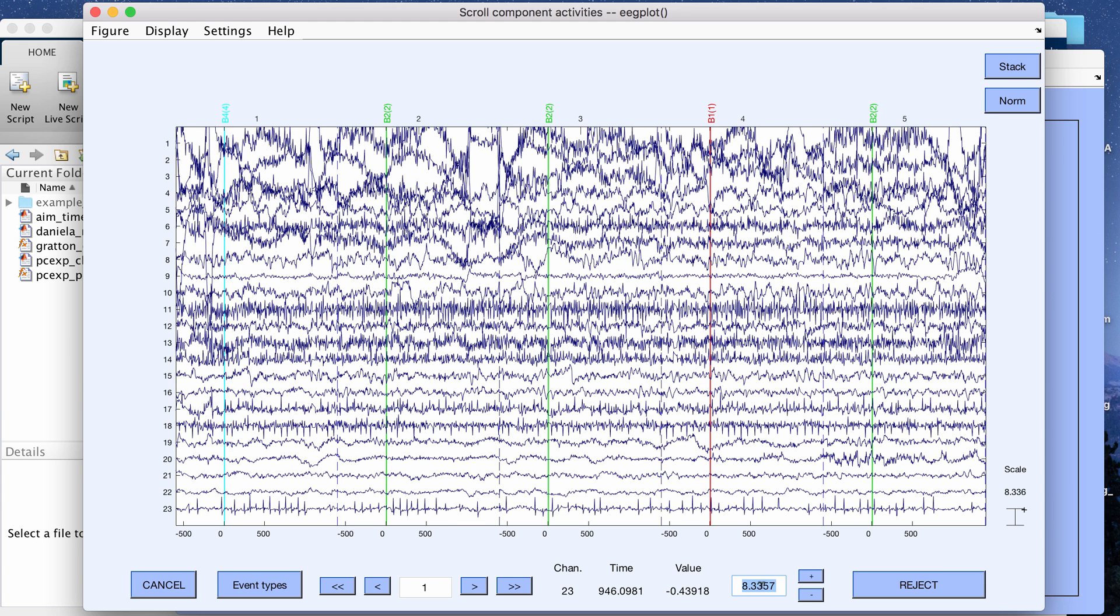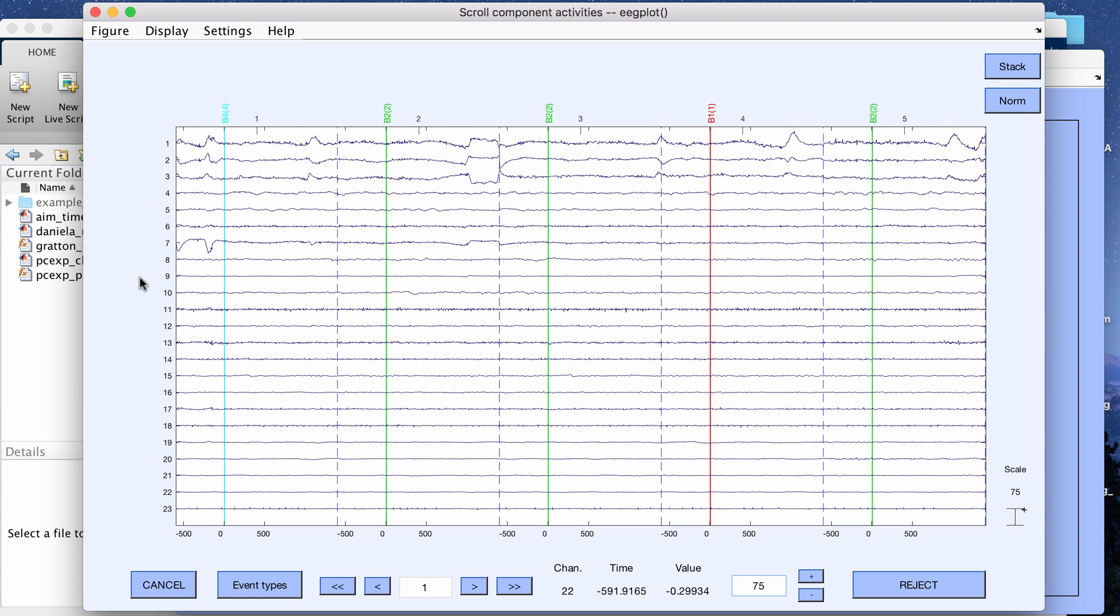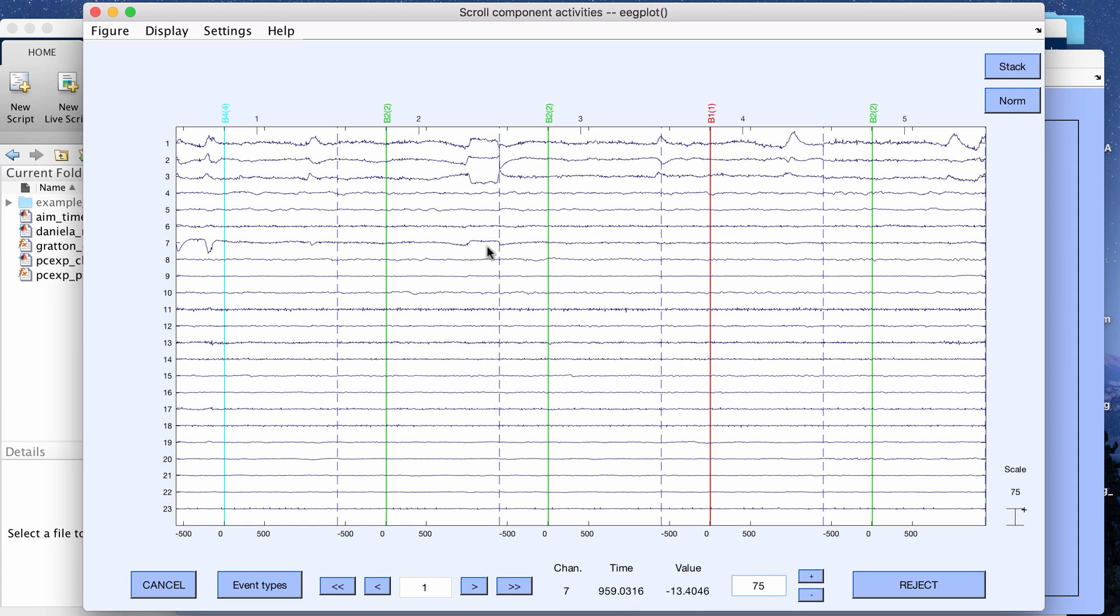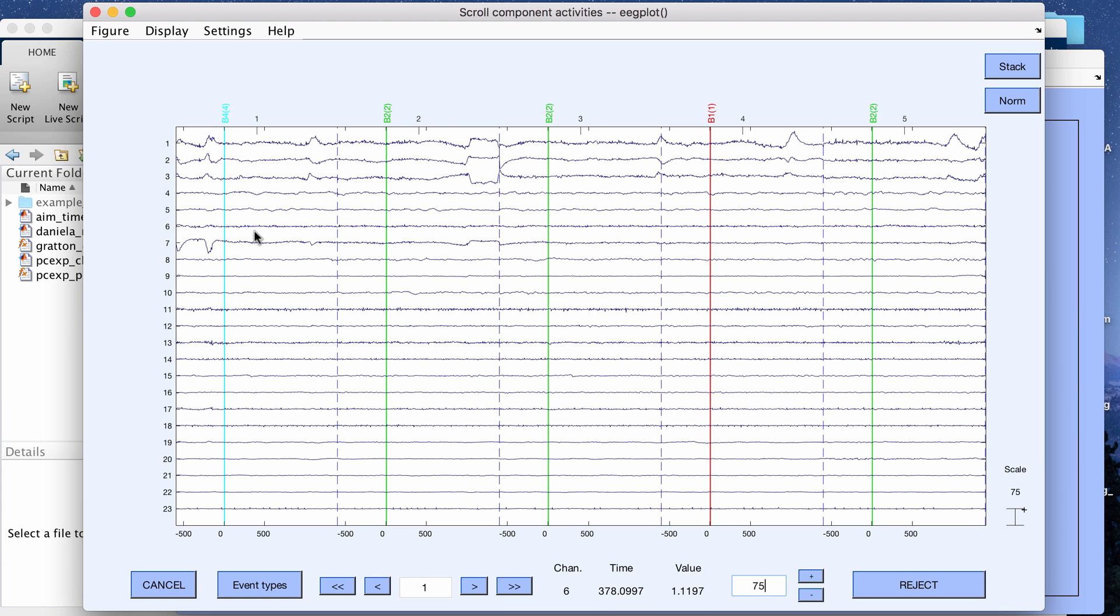That's going to produce 23 independent components. Now when you plot or scroll through the component activities, it will have the 23 independent components listed and the order of the components is based on how much variance they explain per component. The first one explains the most variance followed by the second one and the third one and so on.